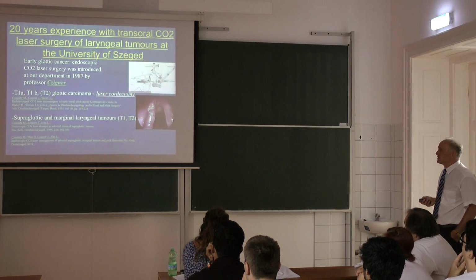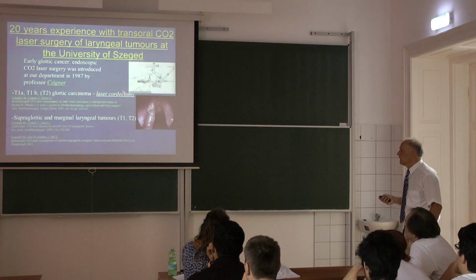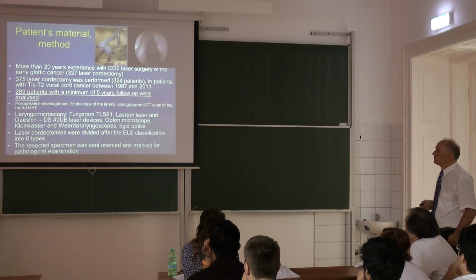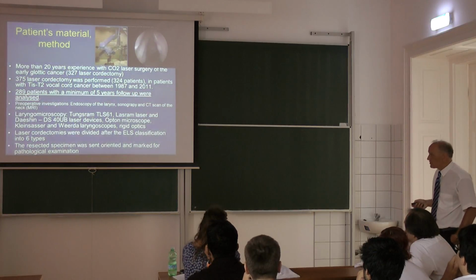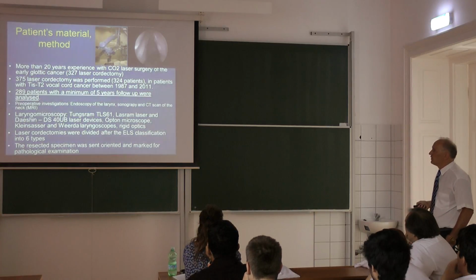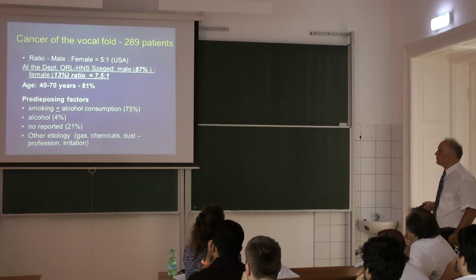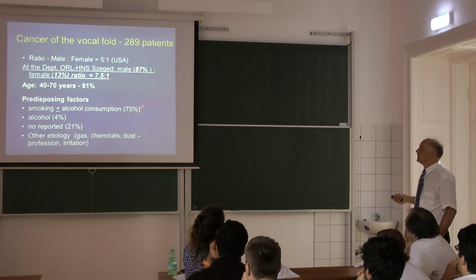We've got nowadays more than 20 years of experience with the CO2 laser technique, and we introduced it into clinical practice for early malignancies with glottic cancer and supraglottic cancer. So we have nowadays more than 500 patients, but almost 300 patients who underwent laser cordectomy were analyzed. That means the resection of the vocal fold tumor.